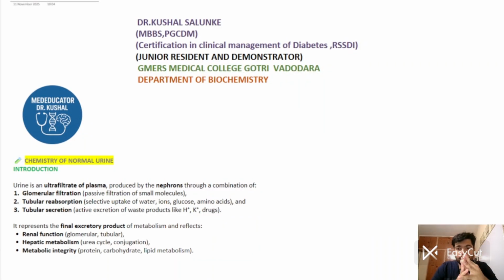In this practical, we are going to discuss the chemistry of normal urine. In this particular practical video, we are going to discuss the normal urine practical. In urine we have two practicals. First is of normal urine and second practical will be of abnormal urine.